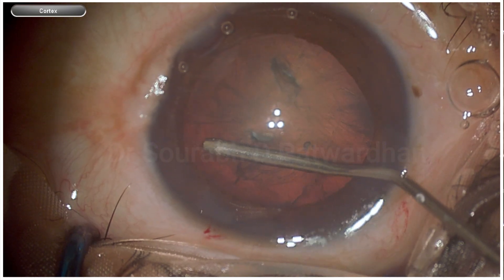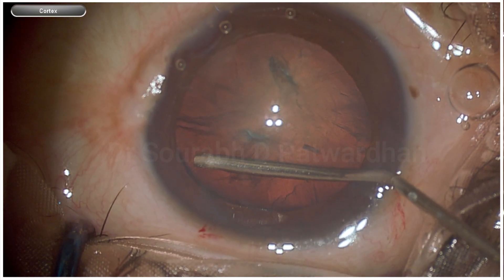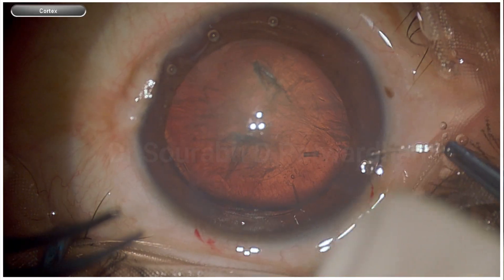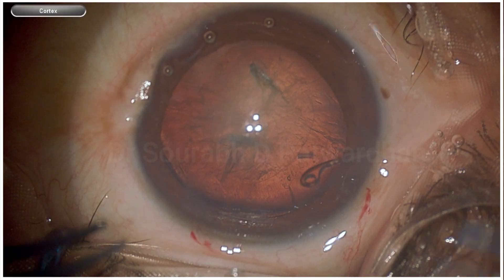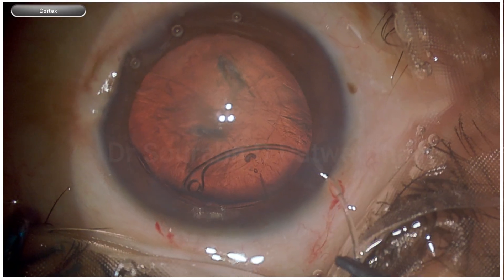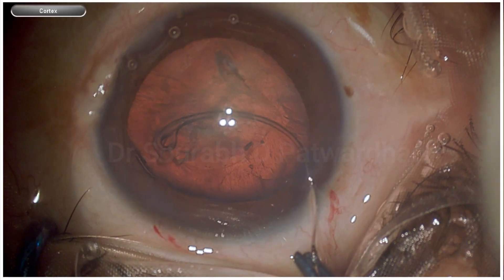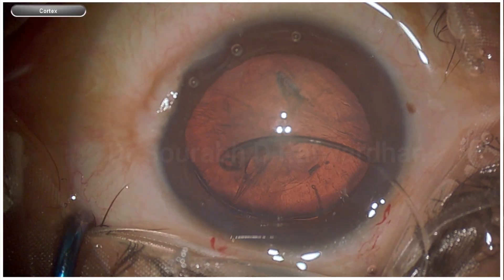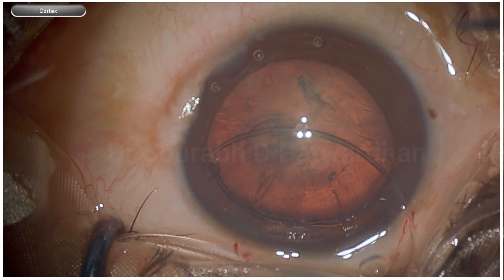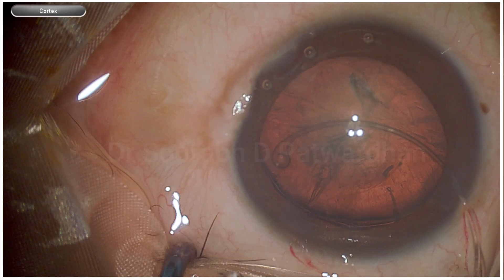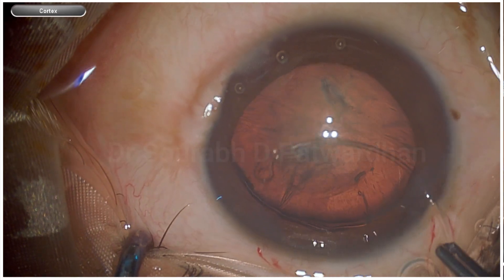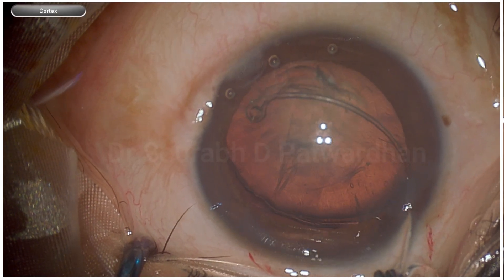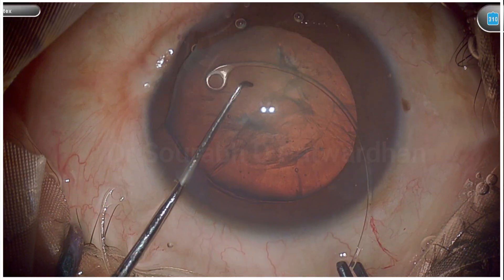This is a case which should be managed by any good anterior segment surgeon. What I am doing here is pushing a little bit of methylcellulose to make some space between the capsule and the cortex, so that when I put the CTR, it helps in reducing the amount of cortex trapped by the CTR. Here you can see I am having difficulty putting this CTR in the bag, because I am putting it in the area of subluxation. I could have gone in a clockwise manner rather than the anti-clockwise manner, which I usually use being a right-handed surgeon.